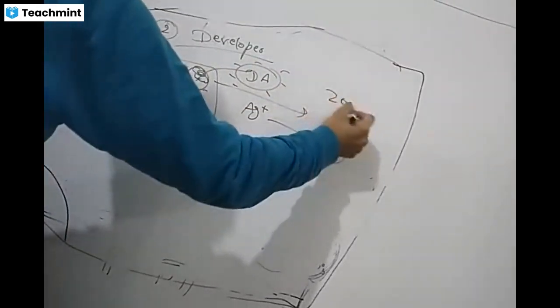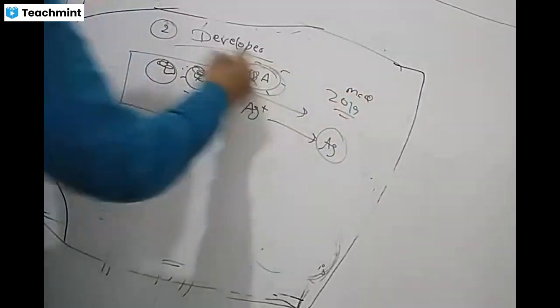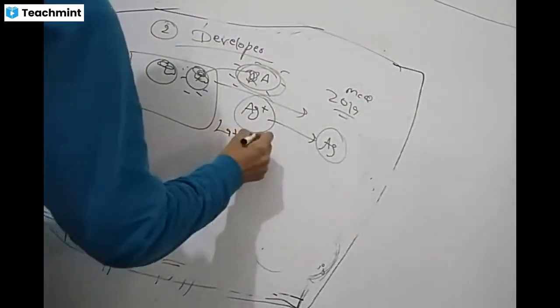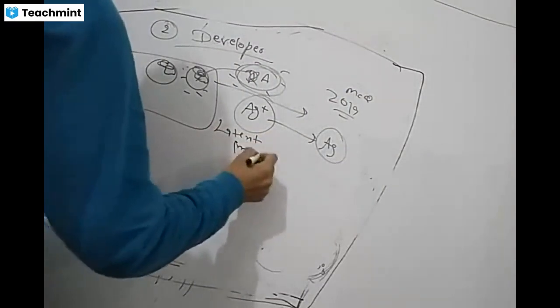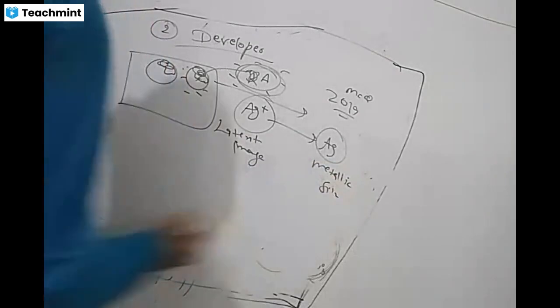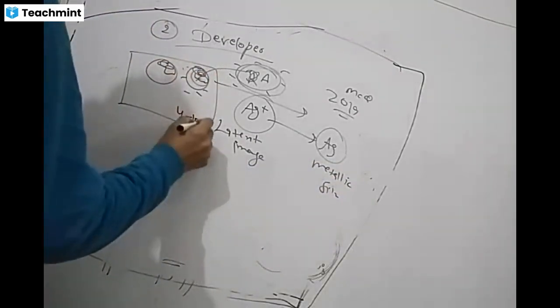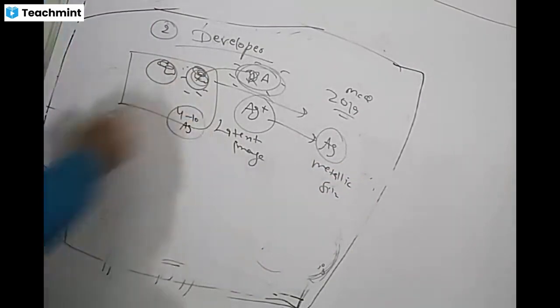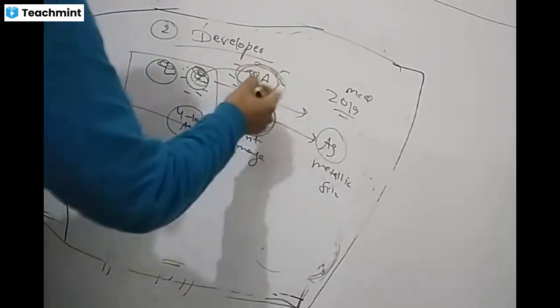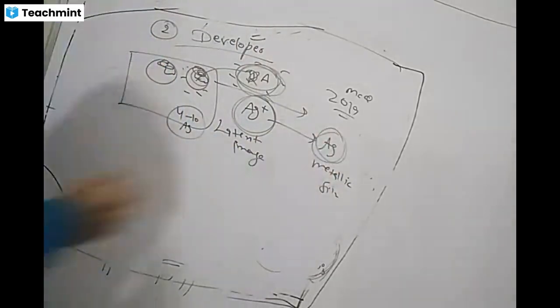ICAR 2019 MCQ. The reducing agent of the developer reduces the Ag+ of the latent image into metallic silver. Because in this part only 4 to 10 silver atoms are there, the remaining are reduced by the reducing agent of the developer solution. So it will reduce.